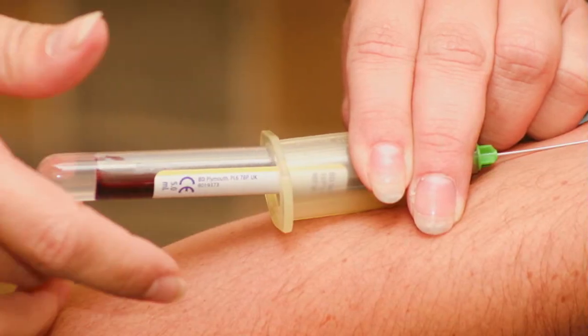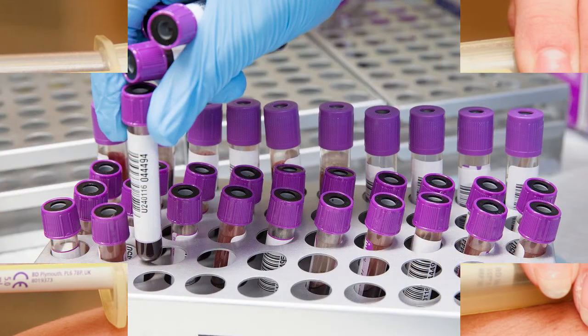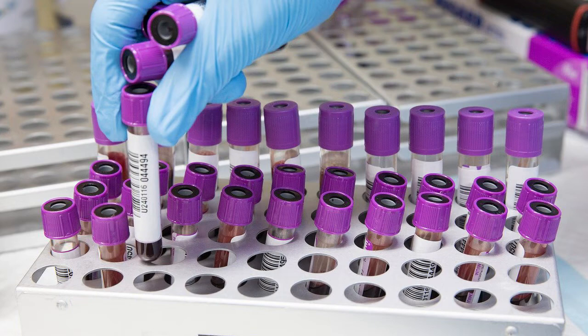Sample collection: 2 to 5 ml of whole blood is collected in an EDTA anticoagulant-containing tube and mixed well to prevent clot formation. A minimum of 1 ml of whole blood is required for testing. Micro collection tubes are not acceptable.